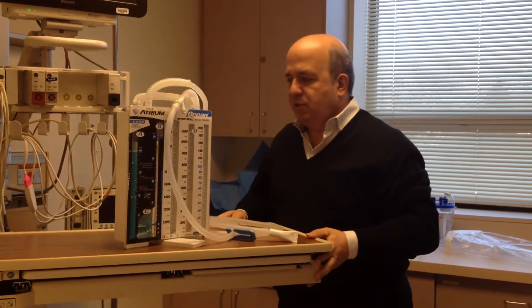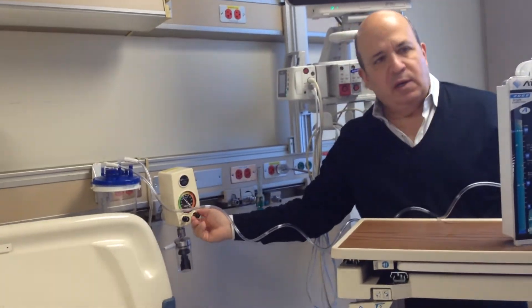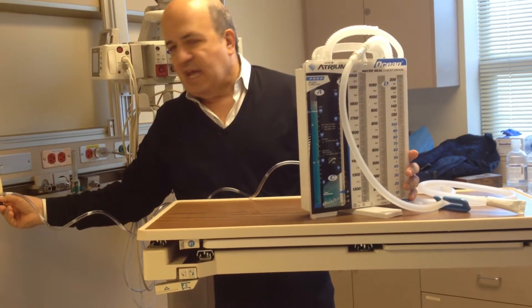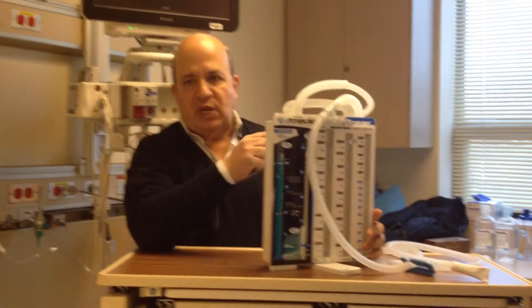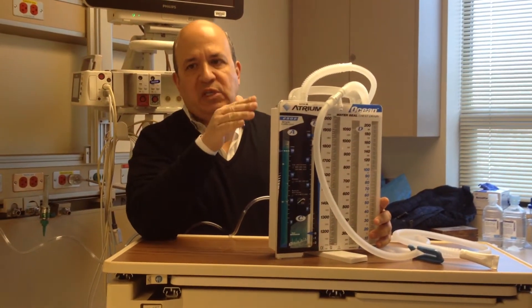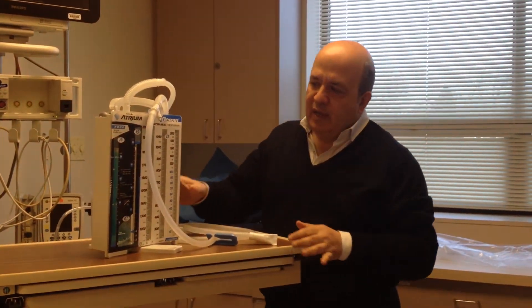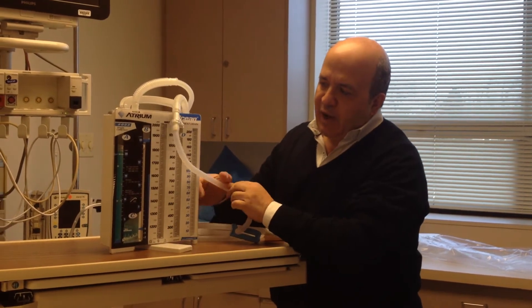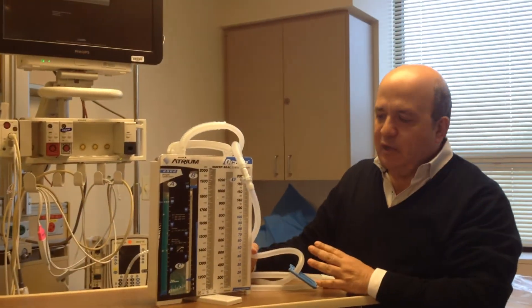This level is 20 centimeters. It is not how high the suction is — it's the level of this water. You can hook this up to a jet engine and you're not going to get more than 20 centimeters of water. So you have to be certain that this level — and this evaporates and pulls over into this chamber — you have to have this at the 20 centimeter line at all times.